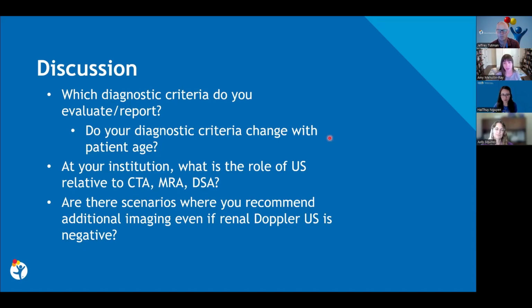Yeah, maybe nephrology and cardiology, and then with a lot of targeted education from us first to make sure that they also are applying consistent criteria to who they're referring. I mean, we get them from the emergency room at like 3 in the morning. And no one's doing their best ultrasound at 3 in the morning, and no one's interpreting their best Doppler ultrasound at, I just made a new word. That's what you would be dictating at 3 in the morning, though.